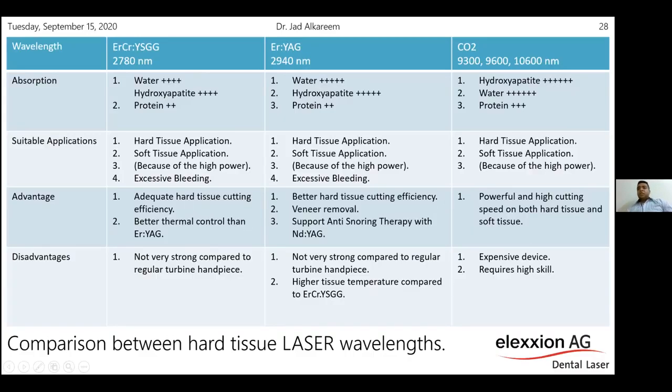The disadvantage is that these devices are a little bit expensive in price, and they require high skill of the dentist. So if the dentist doesn't understand correctly the interactions and the physics of the laser, they will not be able to use this device correctly.